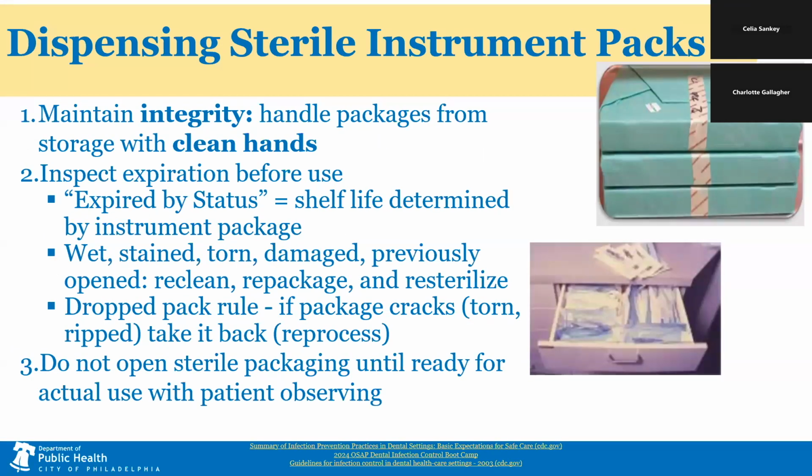When dispensing the packages, handle them with clean hands and re-inspect them for package integrity. If a package rips or is open before immediate use, take it back through the reprocessing. In other words, if the package cracks, take it back. Air and dust contaminate instruments in open packaging.